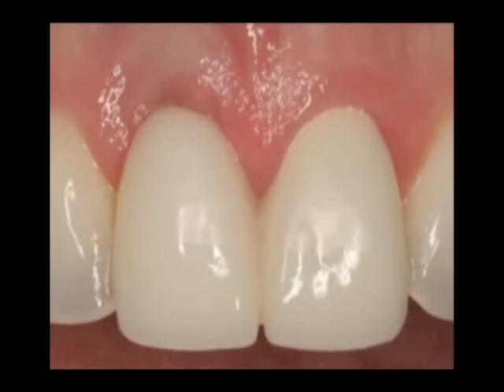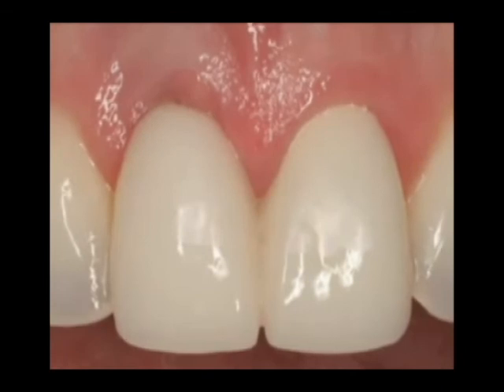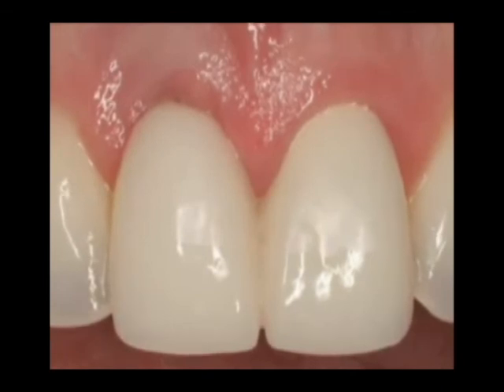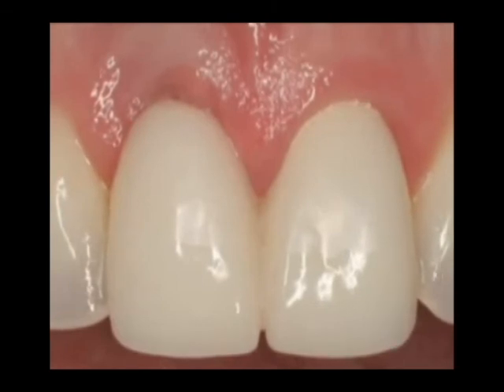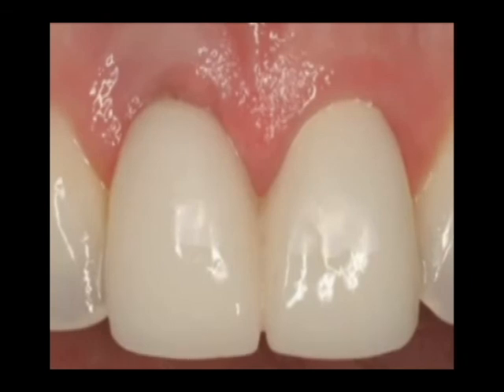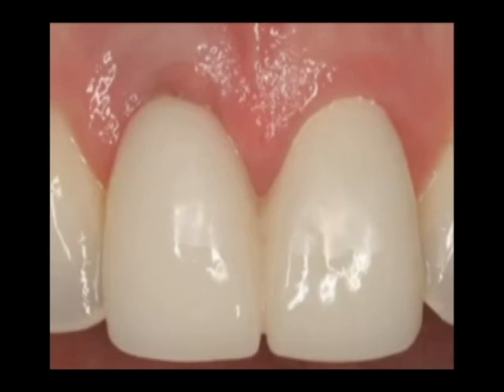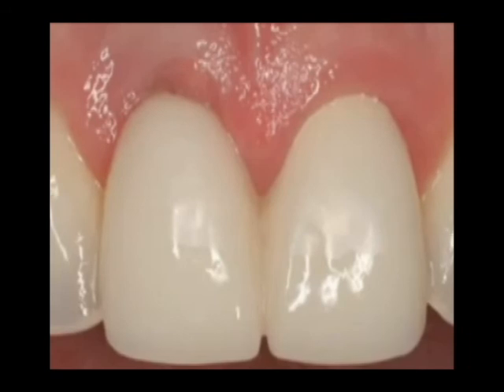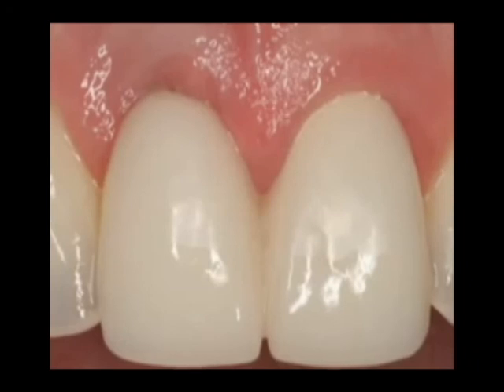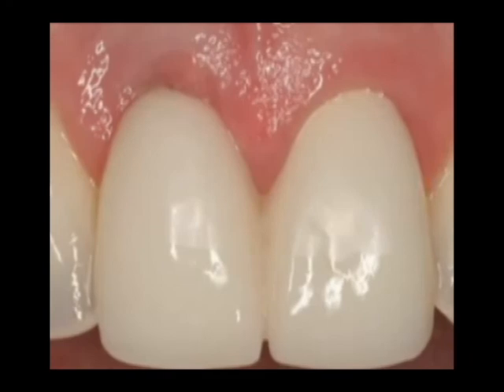So the contours of the temporary restoration we make are specifically identical to the adjacent teeth, and therefore the gum tissue will heal to exactly duplicate the adjacent teeth. And we like to let that set for at least 2 months for 2 reasons. One is to allow the implant and bone interface to grow with each other. And the second reason is to allow that gingival contour that the provisional restoration is forming to fully mature before we take our impressions for our final crowns. So that's why we wait typically 2 months before we proceed with making the final crowns.